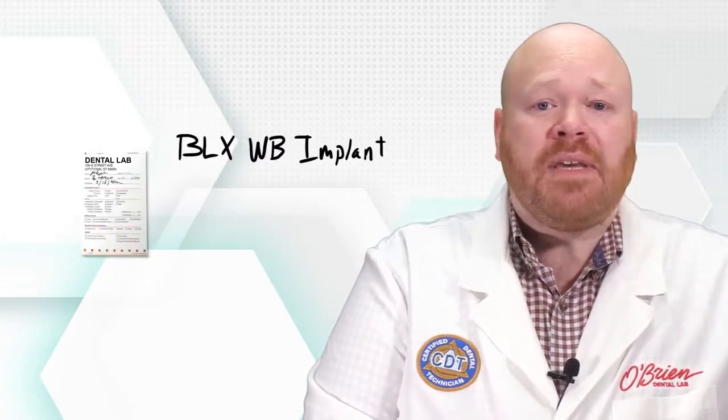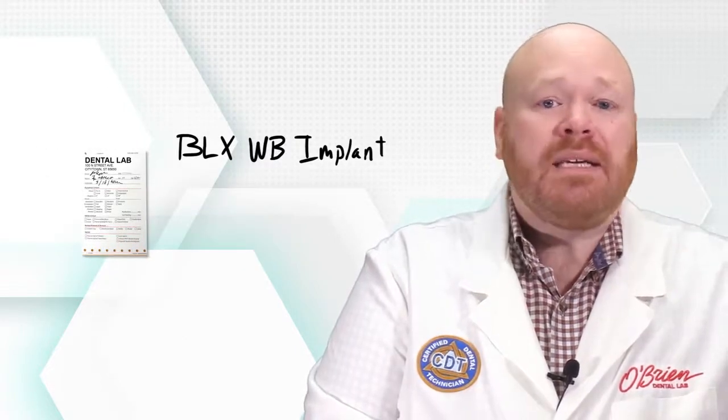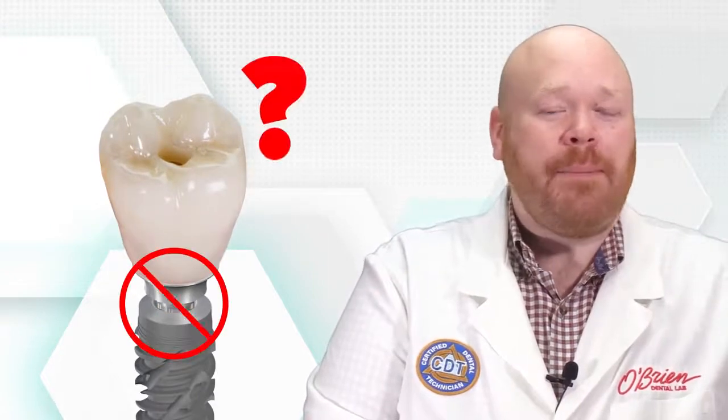The RX sent with the case also mentions that it's a BLX WB implant. The lab makes the crown using a WB abutment, and then when it comes time for delivery, the abutment won't seat. So what happened?